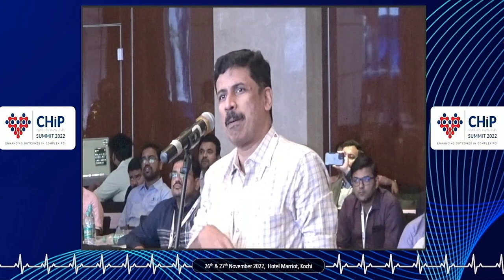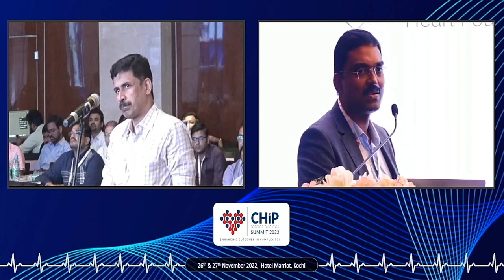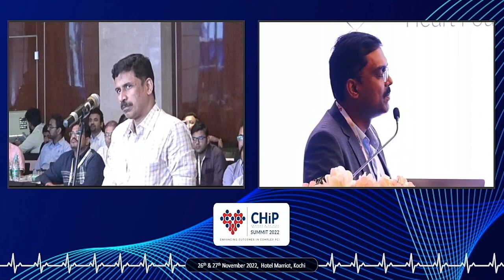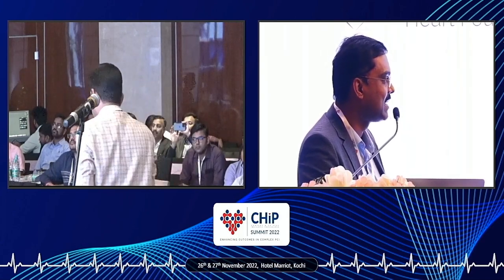No, it depends on the amount of calcium. Angiographically, if you see mild calcium, you can go with the laser. If it is severe calcium, you must go with the 1.25 burr. And generally, it may be an extra cautious step. Usually, I will do it with the Guidezilla in such patients, rather than getting trapped. If you go up front, you can tackle the complications. And Deepak is good in Rota.